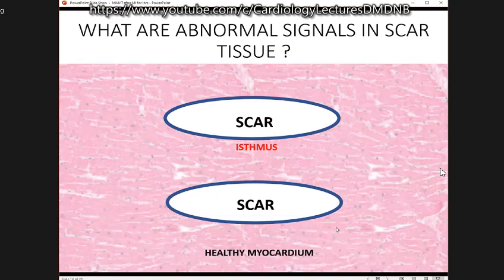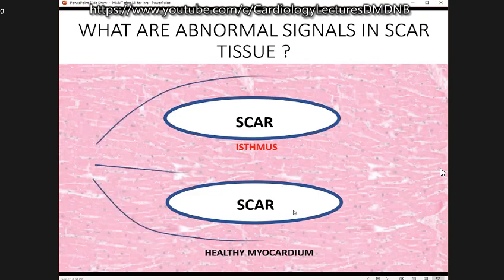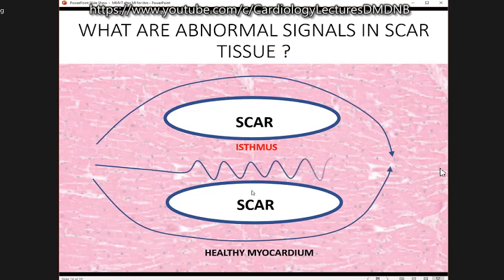And just one concept I'd like to share is, as he showed you a picture with that catheter in the myocardium, you have a picture of your myocardium, you have areas of scar which represent the anatomical blockade that he spoke about, and you have this isthmus region or slow conducting zone, and this is basically a fibrosed area with a few viable myocytes. So when you have an impulse passing through here, it passes through the isthmus very, very slowly.